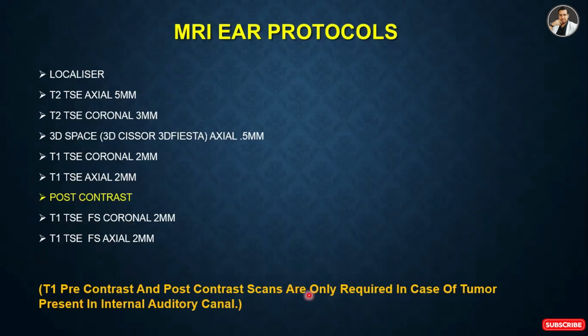These are only required in case of a tumor present in the internal auditory canal. If there is any tumor, then T1 post-contrast and T1 axial are needed.